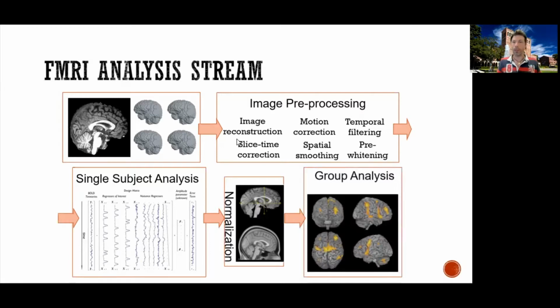So once we've done a first level analysis on everybody, how do we aggregate those data into one group analysis? What I'm showing here is the typical way in which an fMRI result would be pictured, which is a standard brain under some pattern of activation from the group of participants.